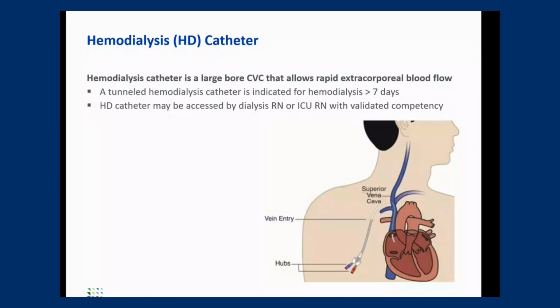HD catheters, so really only dialysis nurses or ICU nurses are able to access these catheters, and dialysis nurses are usually the ones that change the dressings every week or as needed.